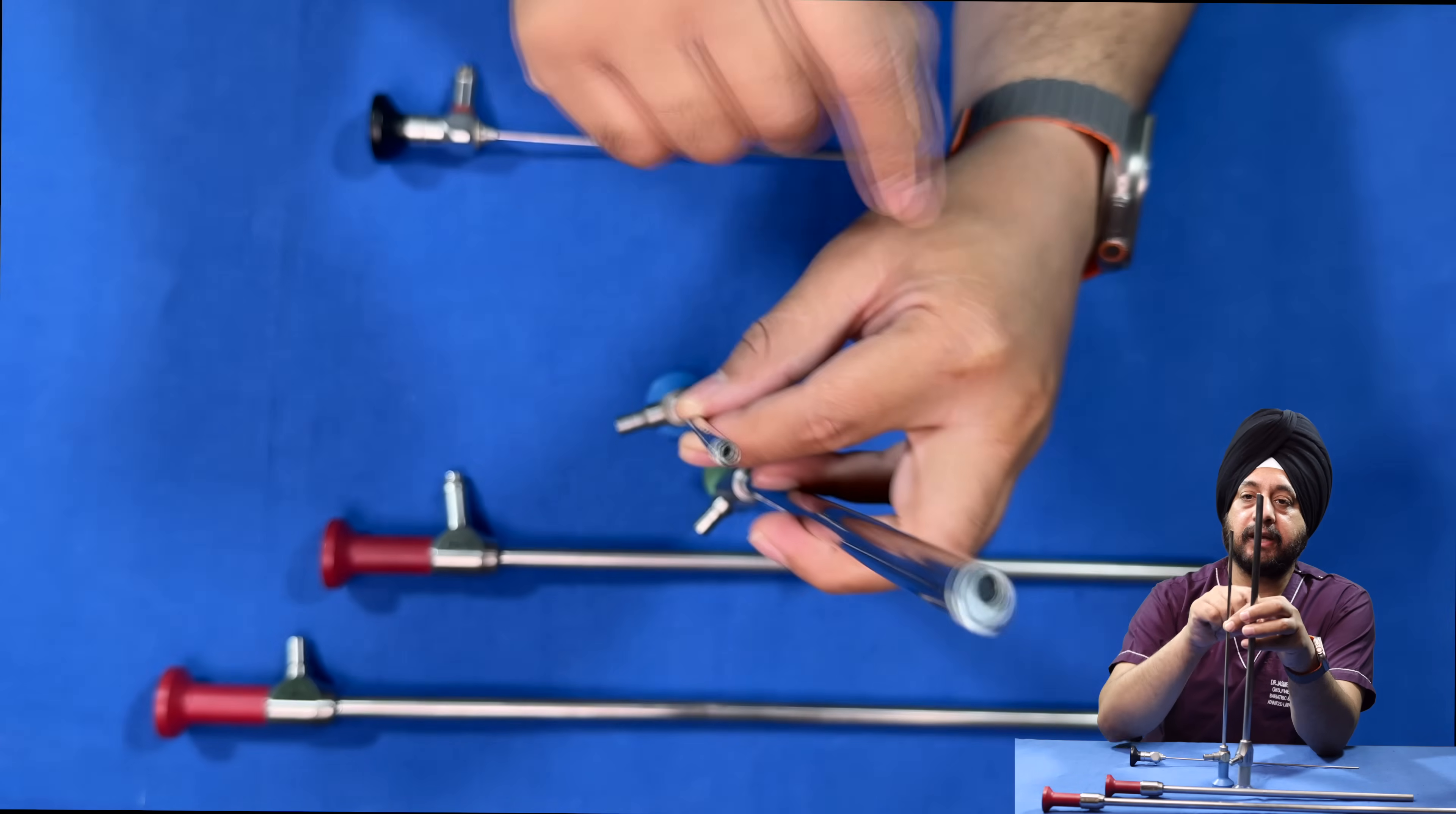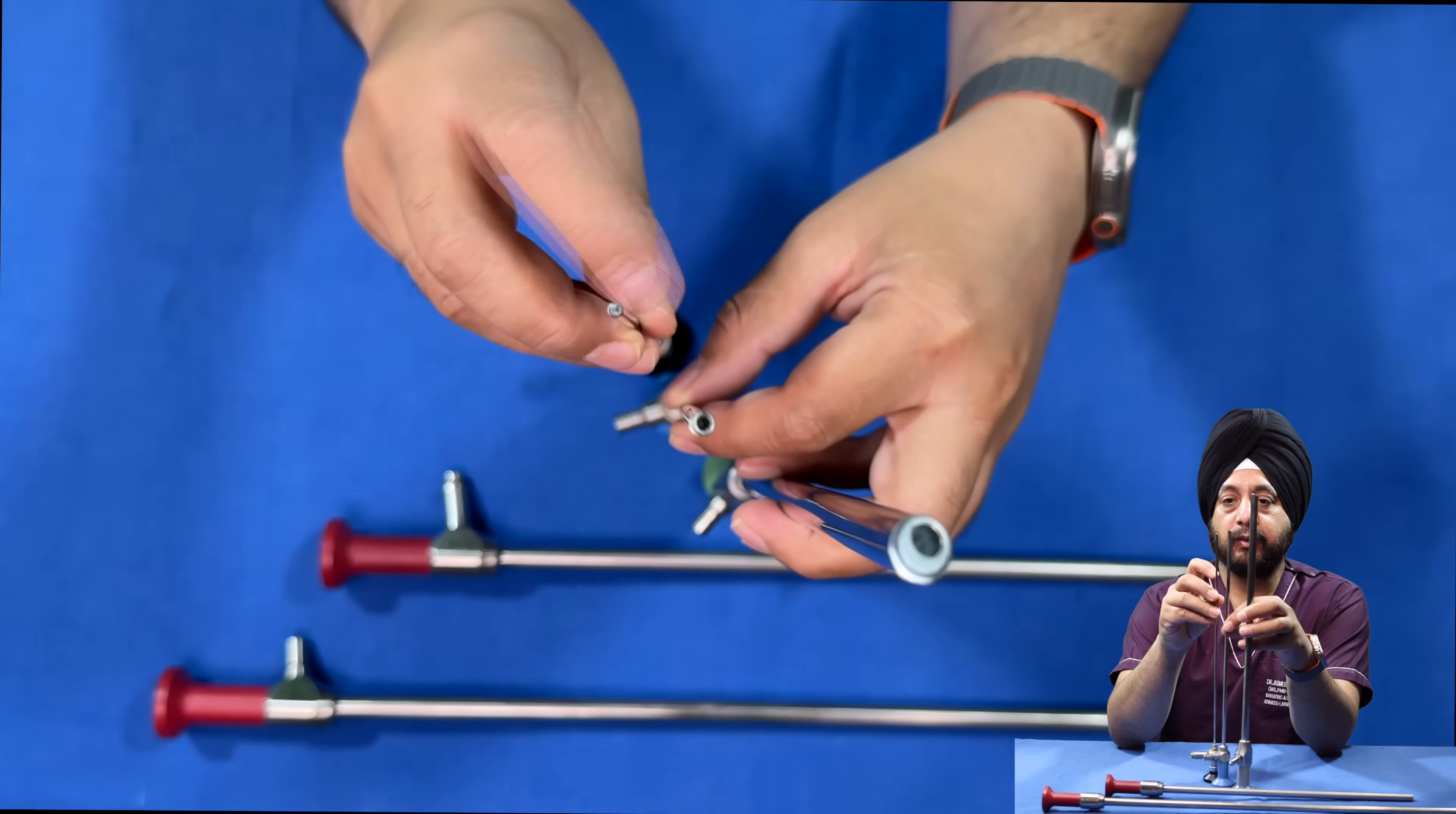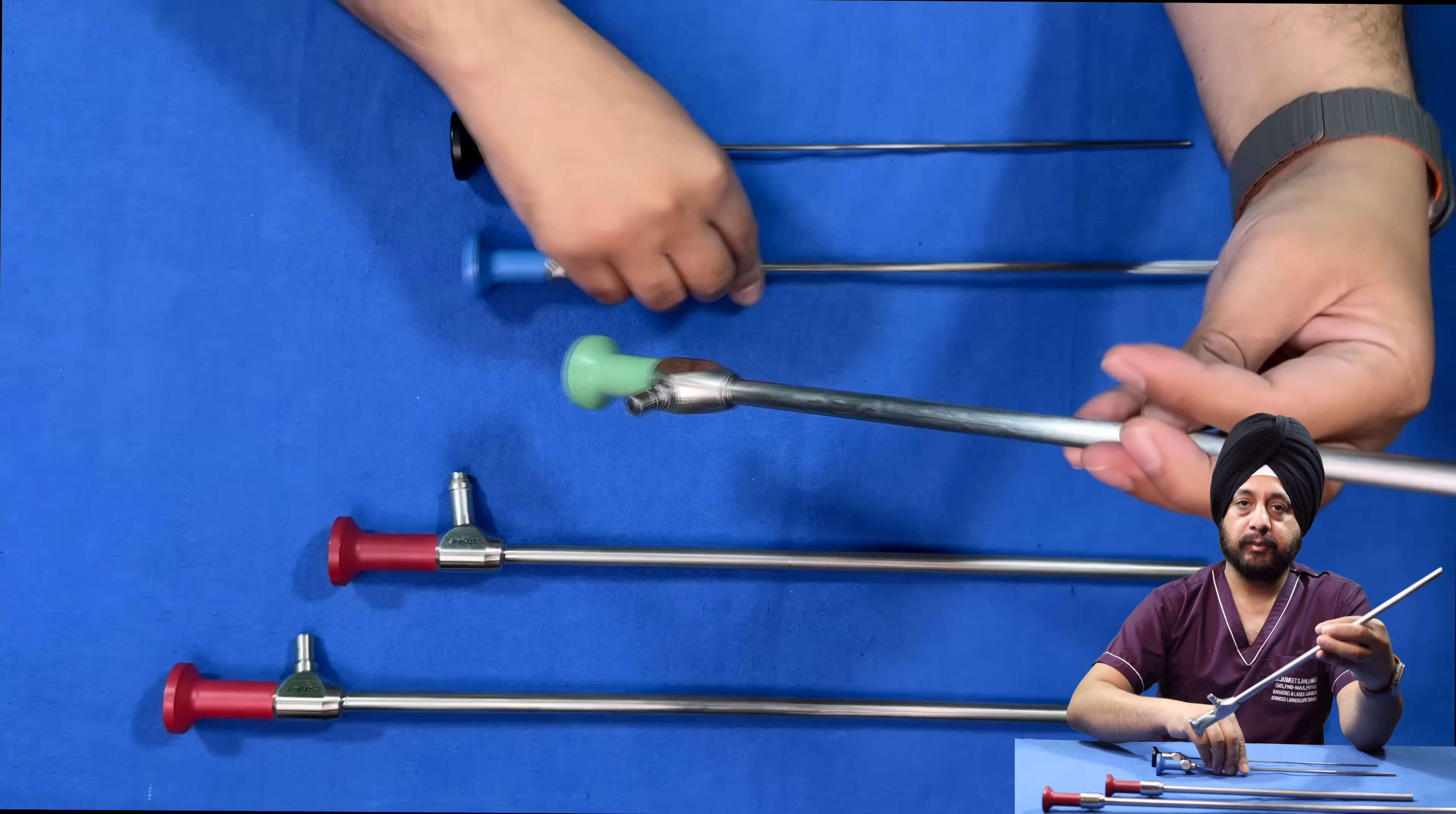The lens is much bigger in the 10 mm compared to 5 mm. With a smaller scope, the lens is even smaller and the fiber optics are even smaller, so they conduct less light. The light transmitted back is also less, so the image quality is inferior for a smaller scope.